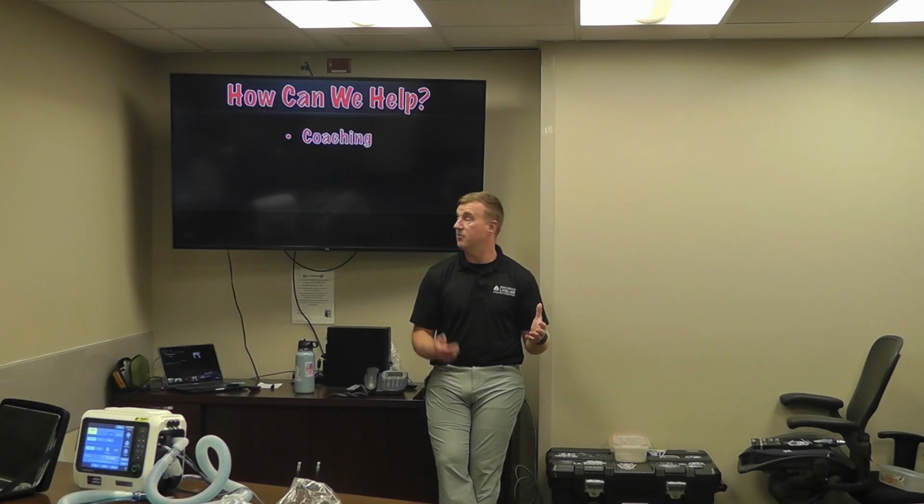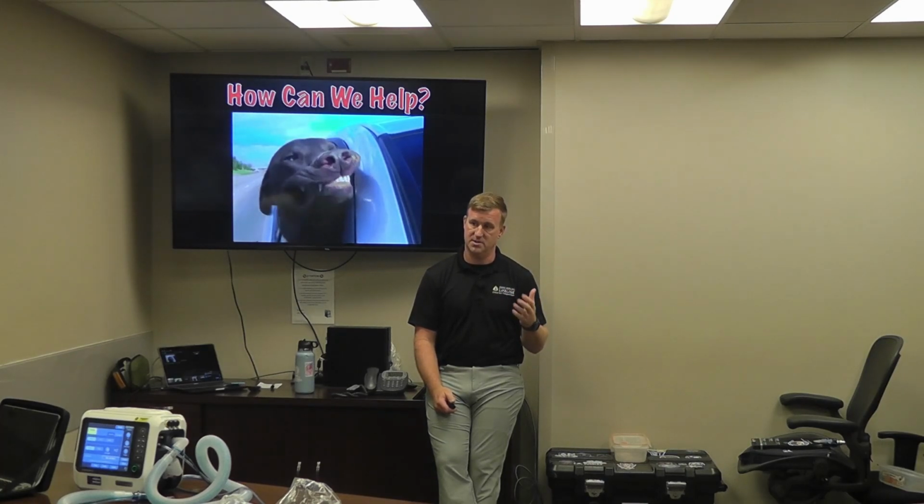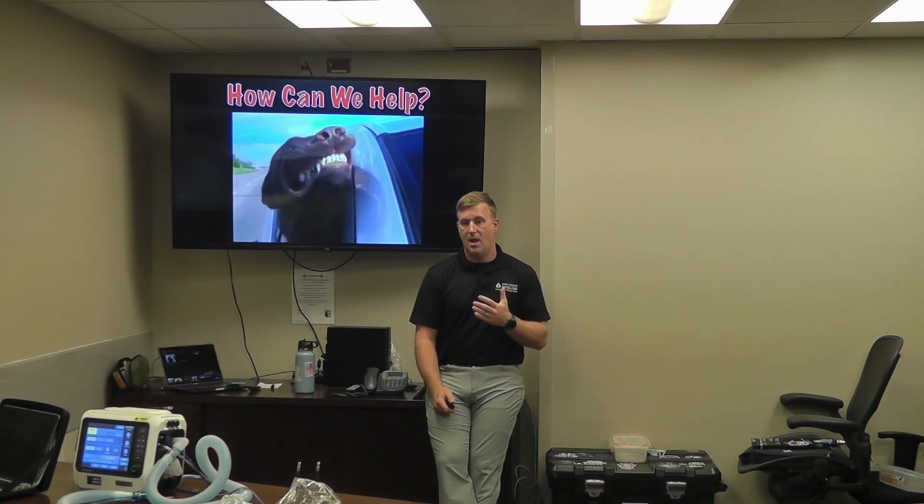And the reason we have to coach them through it is because this is what it feels like to be on non-invasive, right? It feels like sticking your head out the window at 40 miles an hour, and it's uncomfortable. How many of you guys have seen people fail non-invasive, right?